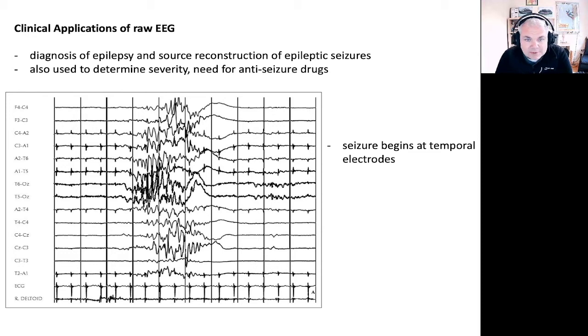So the brain damage created by having to ablate the focus of the seizure is a much better option than allowing the seizures to continue. What you could do in that case is record EEG from a set of electrodes across head space and try to infer from the temporal pattern of activity across the different electrodes where in the brain space the seizure is starting from.